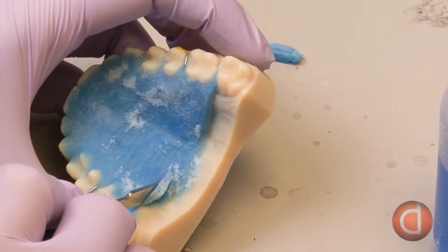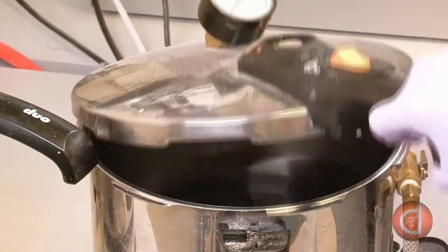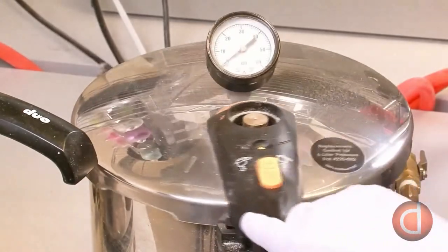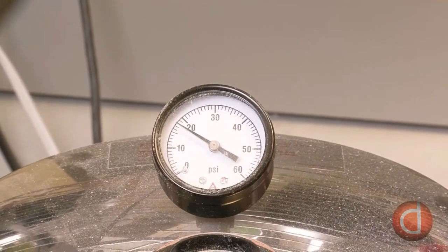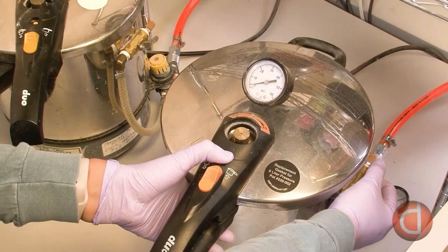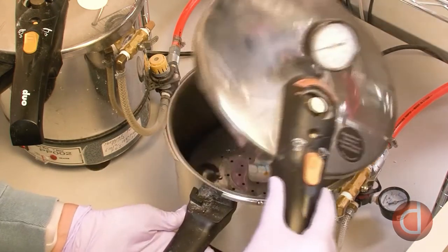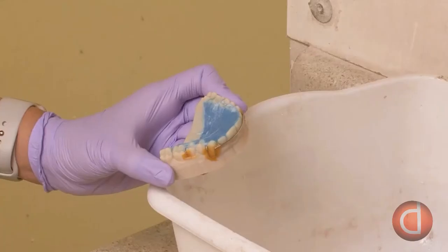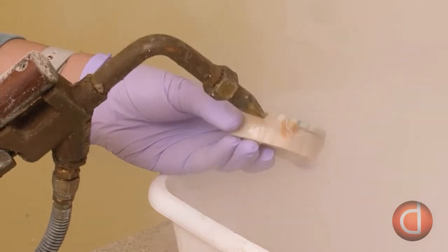Excess material is scraped off with a knife to form a straight edge at the rear of the palate. She places the finished model in a heated pressure cooker, pressurized to about 20 pounds per square inch, and the model cures for about 10 minutes. The pressure removes any air bubbles in the acrylic and helps speed up the curing process.